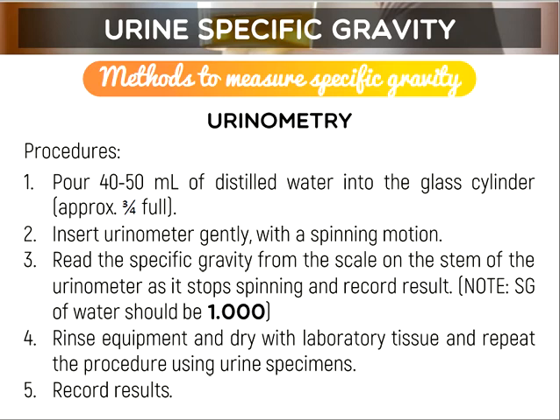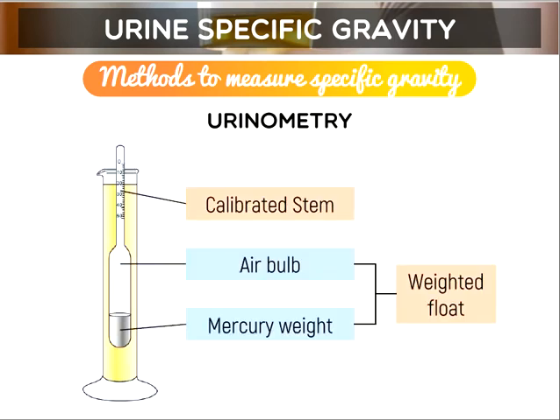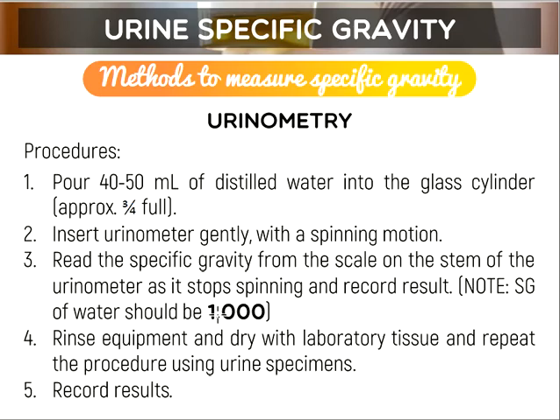Imagine the urine is here. Before you drop it, you should hold it here, and then spin it as you drop it. Like, twist it while dropping it.